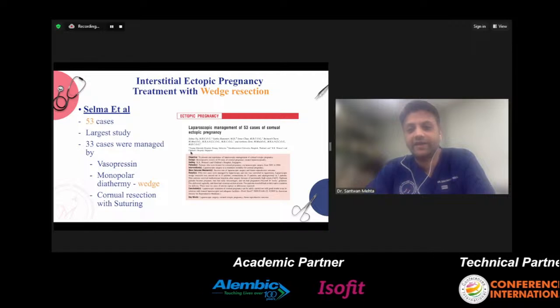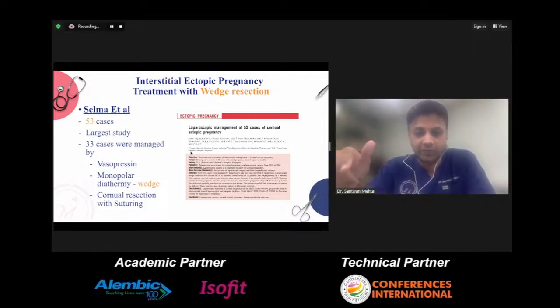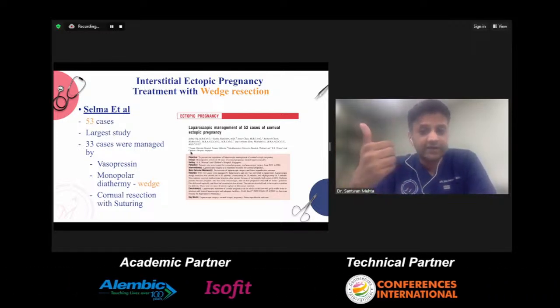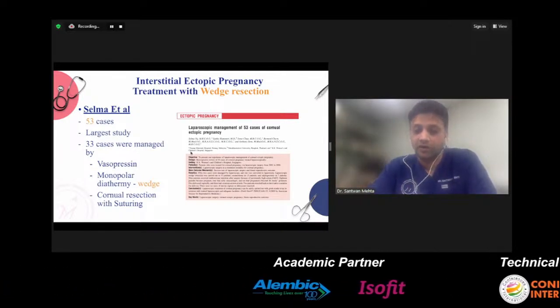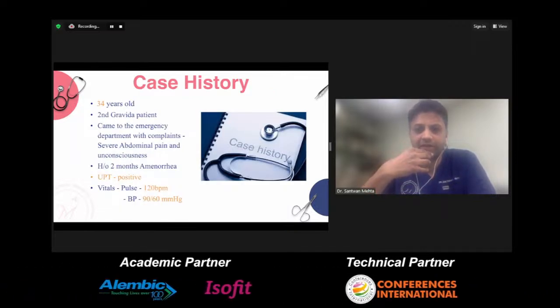It's technically a little bit complicated. You have to inject vasopressin, apply monopolar diathermy, take out the wedge, and then do the cornual resection and the suturing. So it's technically demanding, and as studies show, there are many cases of uterine rupture in the next pregnancy. So today I'm going to show a very simpler method to deal with such cases.